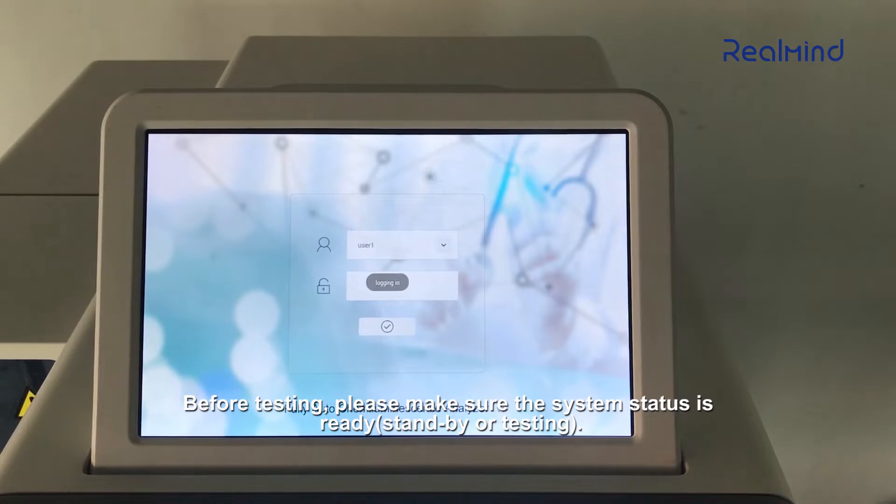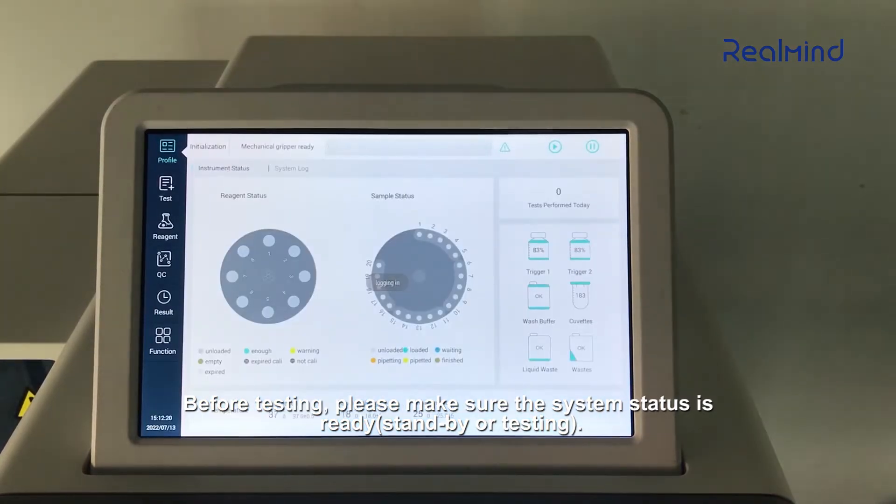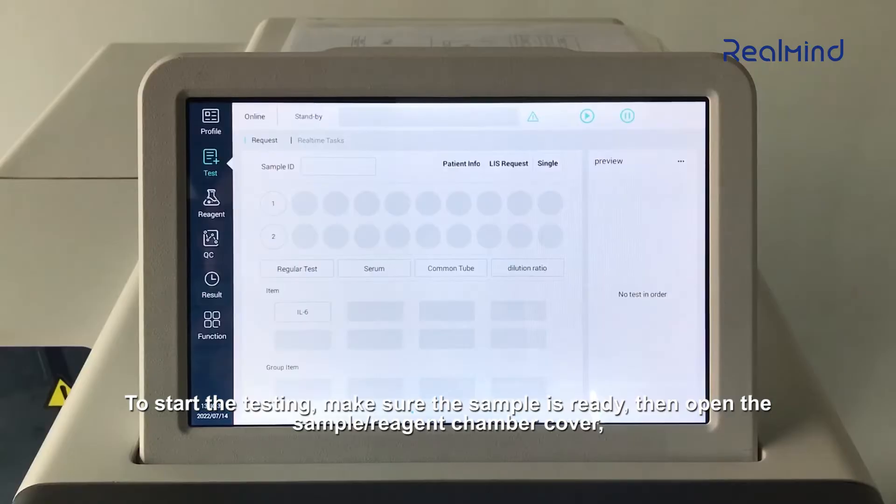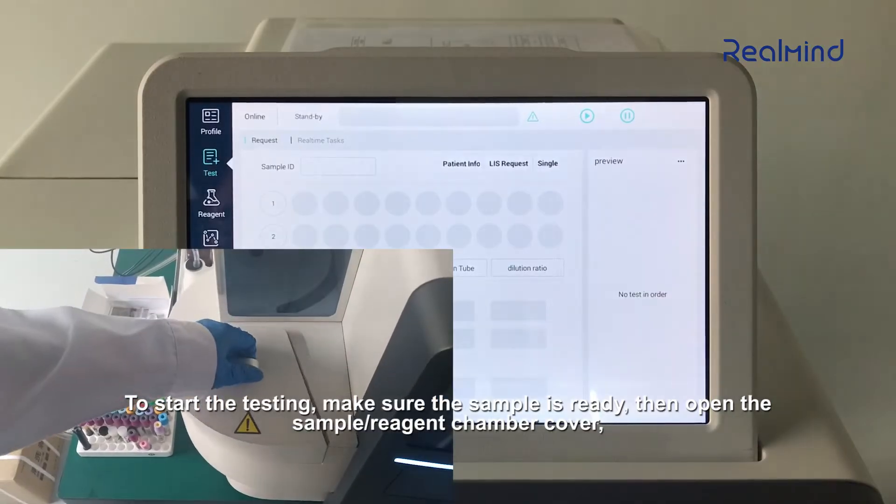Before testing, please make sure the system status is ready — standby or testing. To start the testing, make sure the sample is ready. Then open the sample reagent chamber cover.